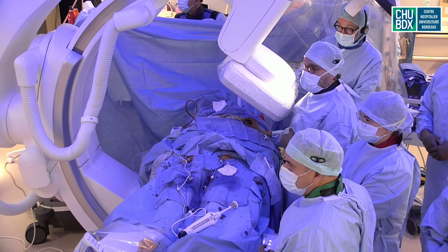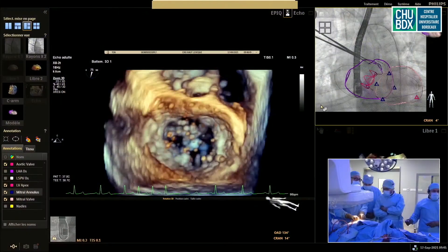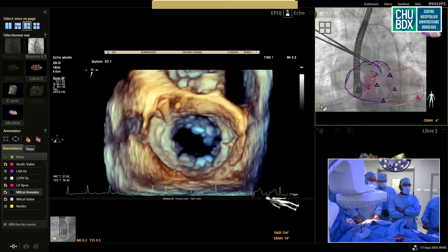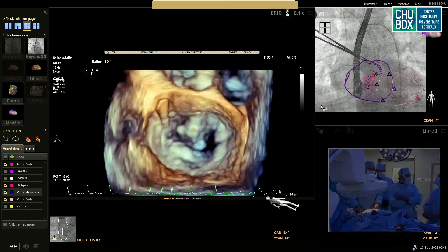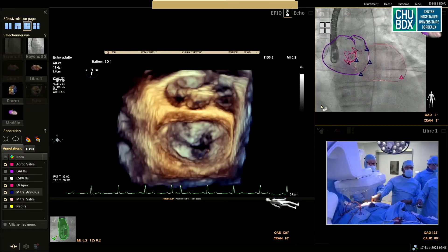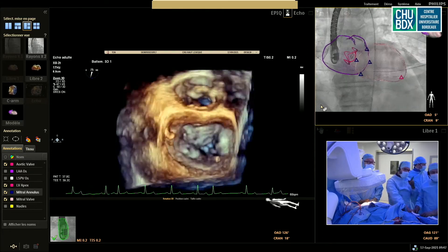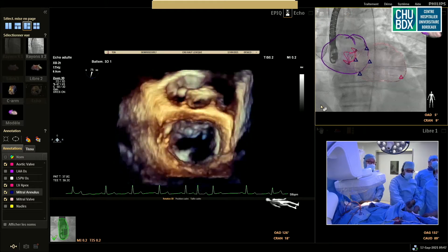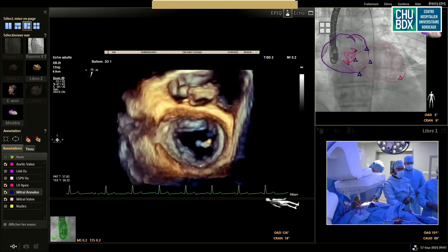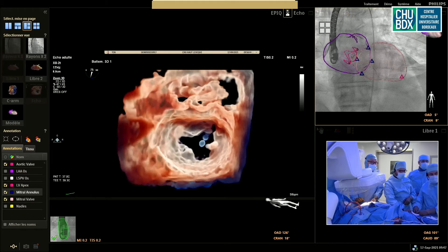to do this first live case ever directly transmitted from CHU de Bordeaux. I'm not sure we have a lot of time for a huge description of the valve. As you understood, first we thought that it's coming from an ischemic cardiomyopathy with LV dilation with these beautiful views. You can see limitation restriction, especially on zone 1 and zone 2. You can see something else on this view — there is an indentation which is quite deep, probably a 1 cm indentation, and it's one of the reasons that we didn't go to the matriclip technique.